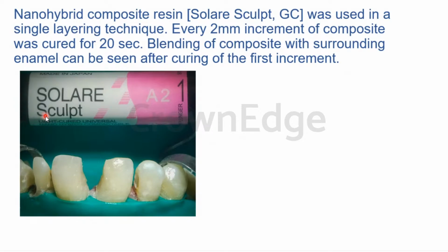Going back to my previous question, bonding agent, Vaishnavi says, should bond to tooth, we should do air dry. In order to bond to the tooth, we should do air dry. No, not again. Shishan says to avoid pooling of bonding agent. Very good. That is very close to what I was looking at. That's an excellent answer, but I'm looking at a little more technical aspect than that.